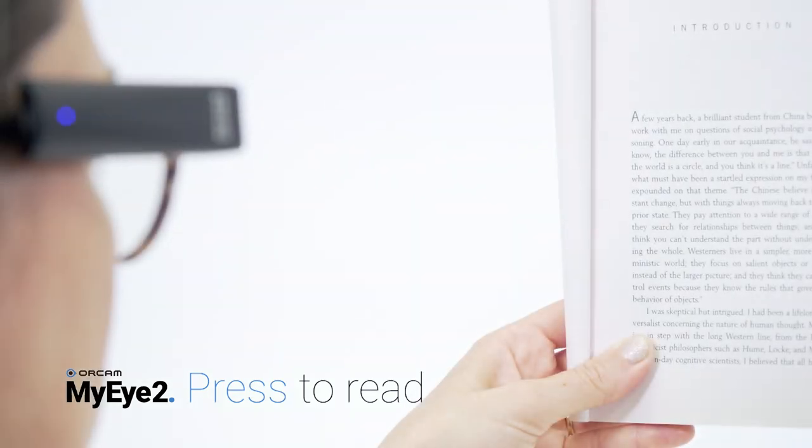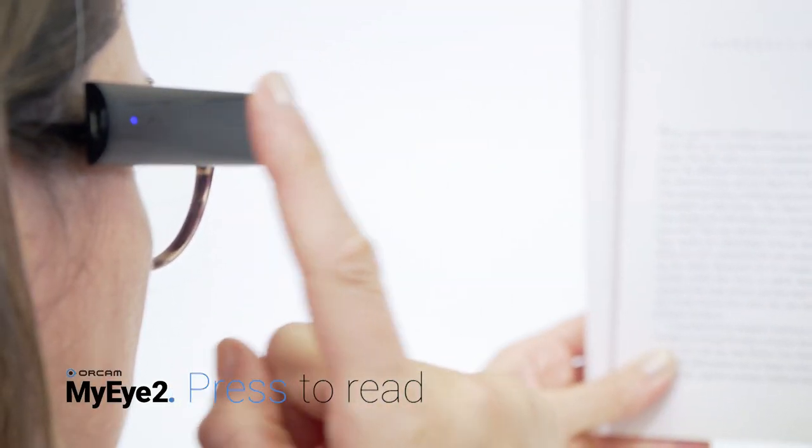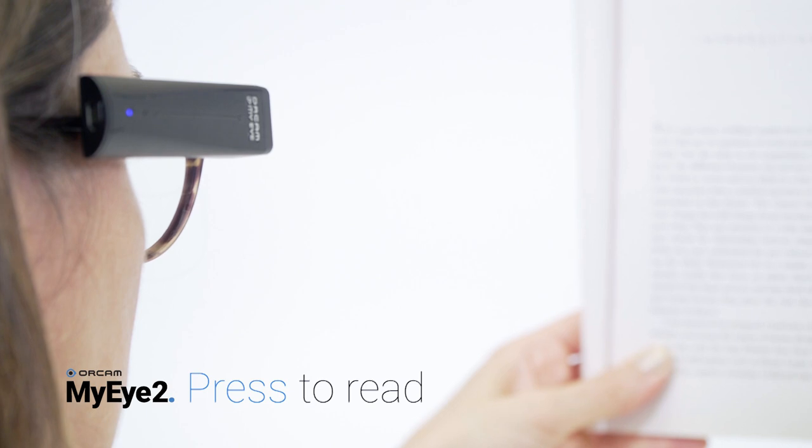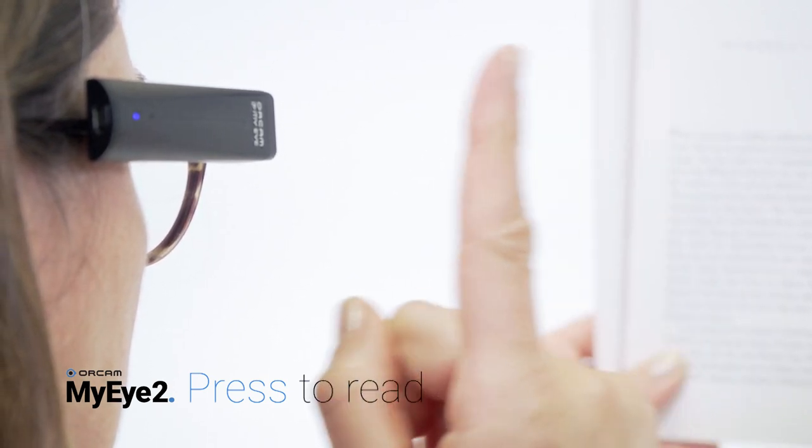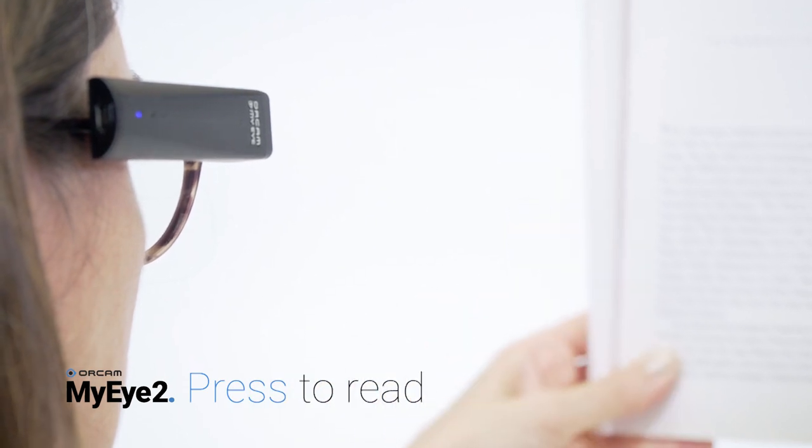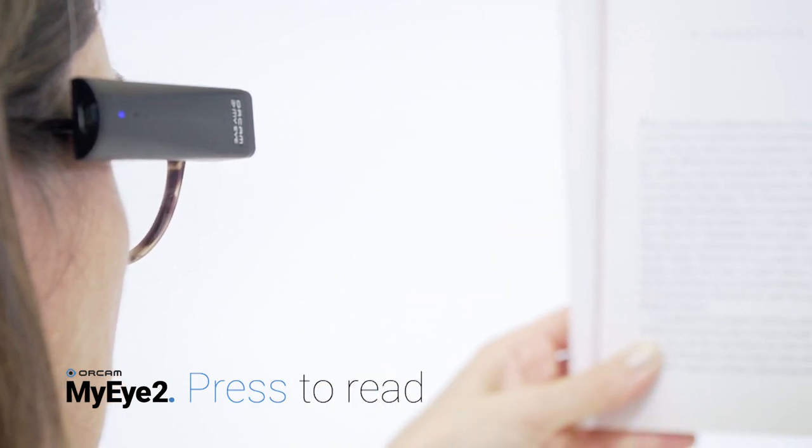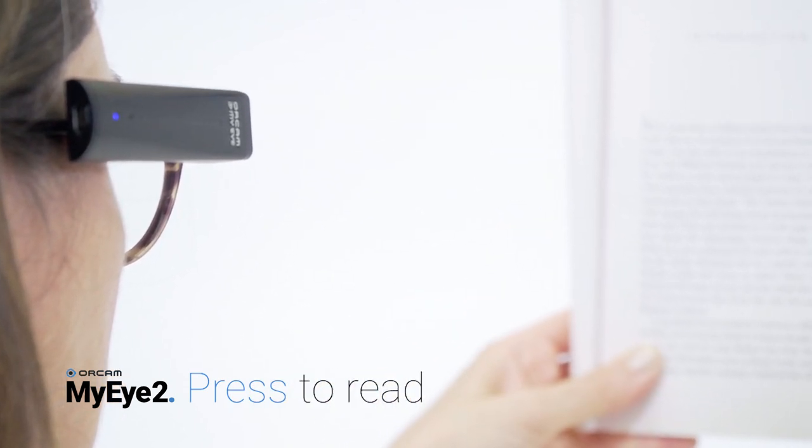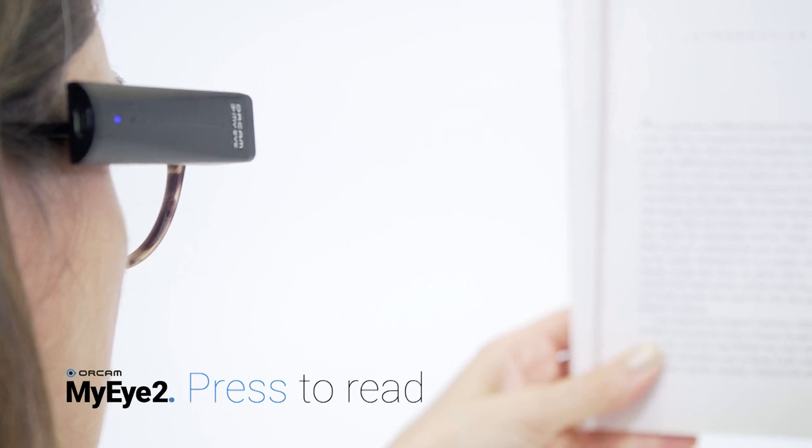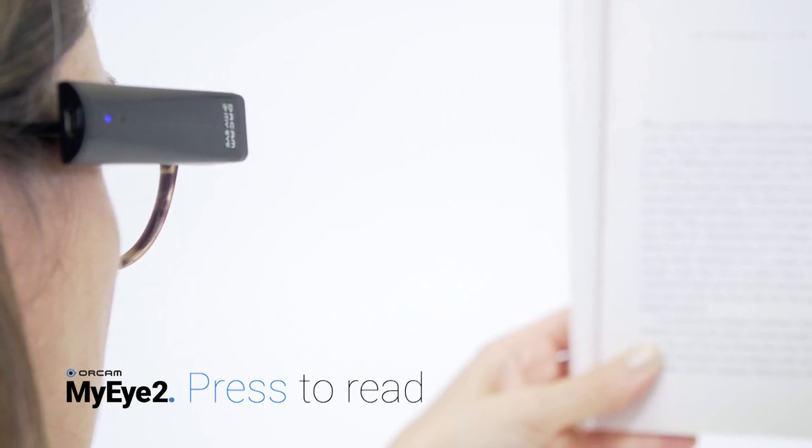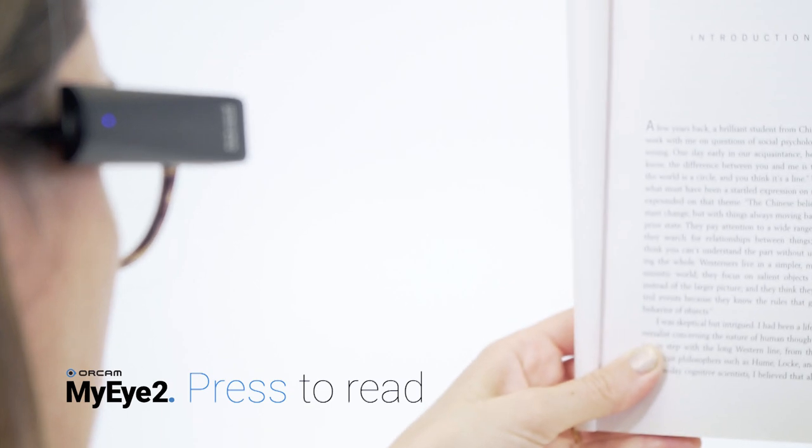Press the touch bar on the device when you wish to read one or two full pages or a sign. Face the text you wish to read at eye level. Press the touch bar. You will hear a click, followed by a camera shutter sound, and beeps as the device processes the picture. Your device will begin reading the text and sound a chime when it is finished.